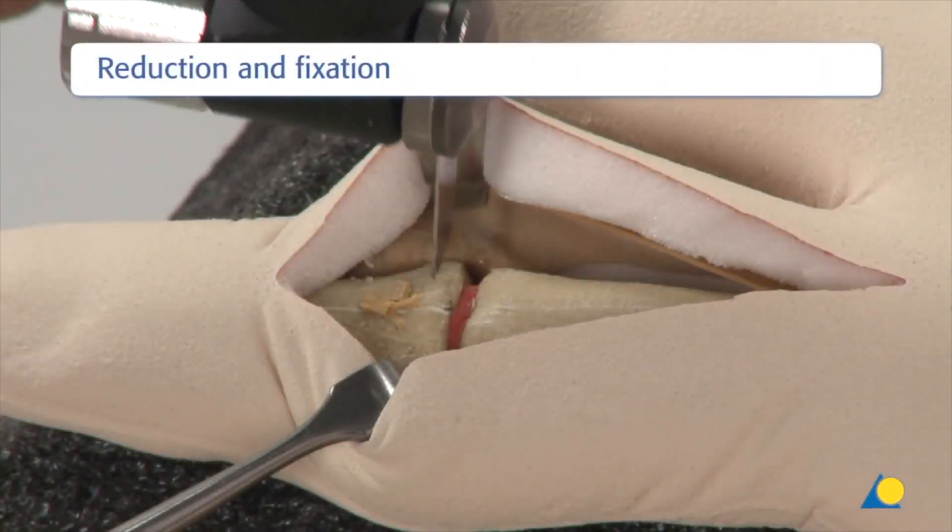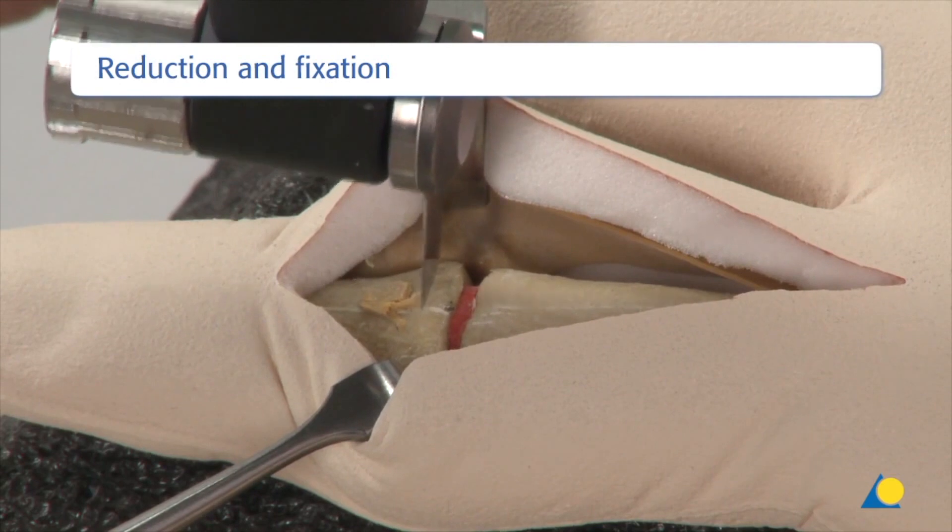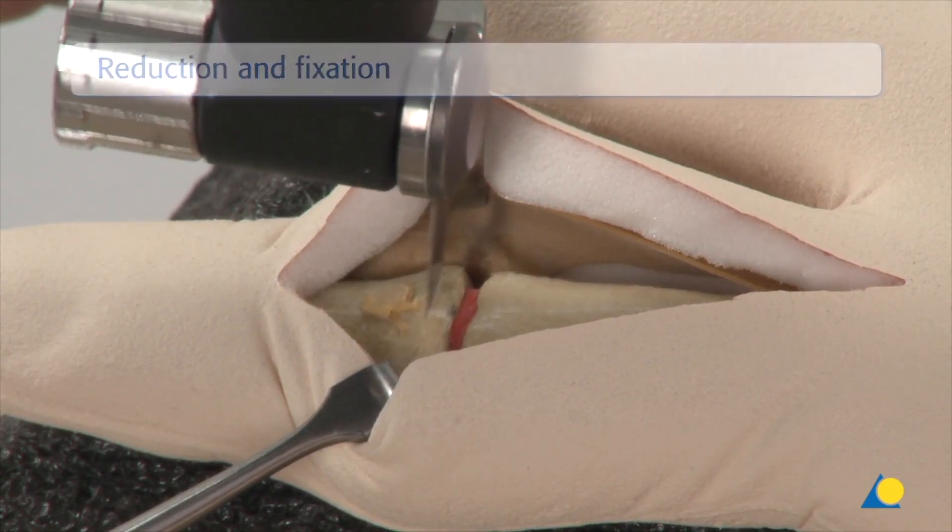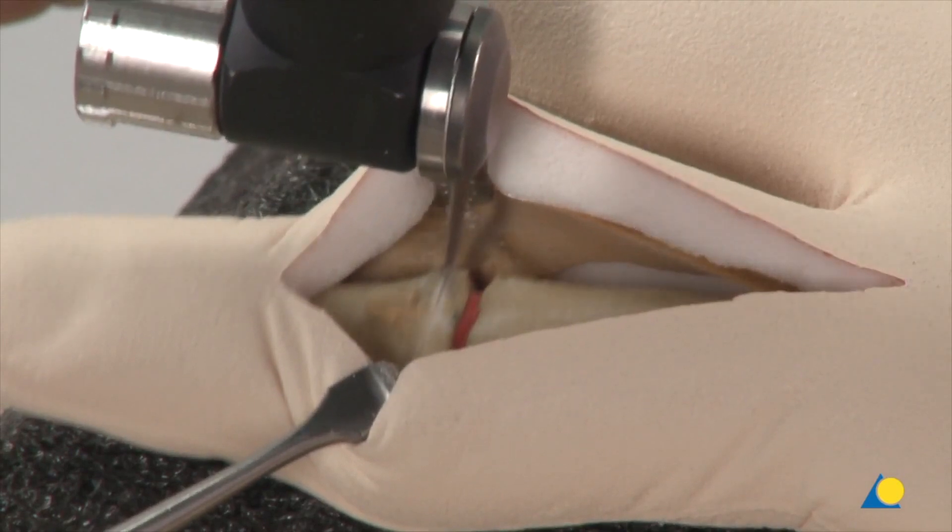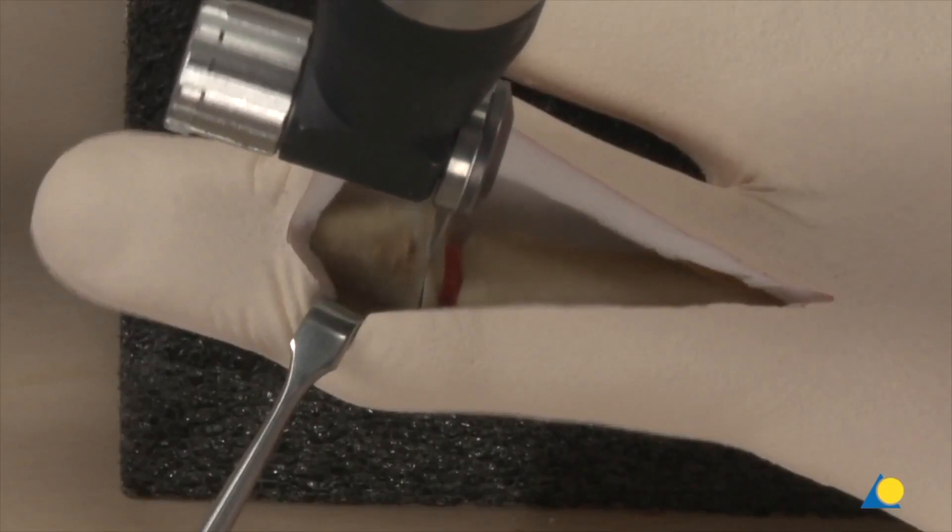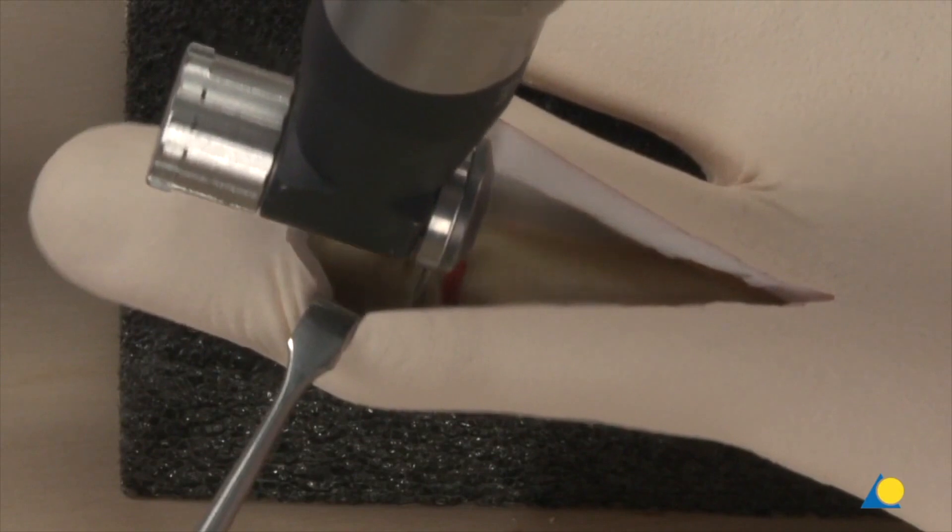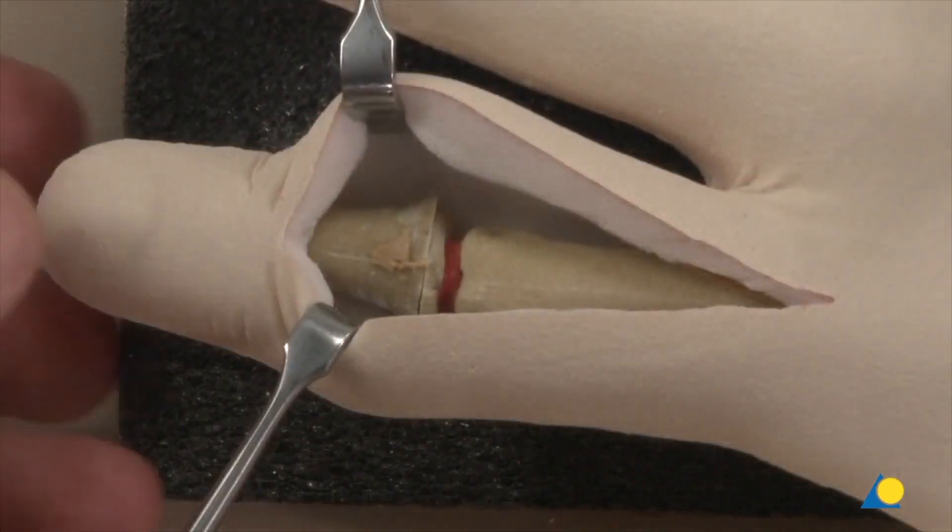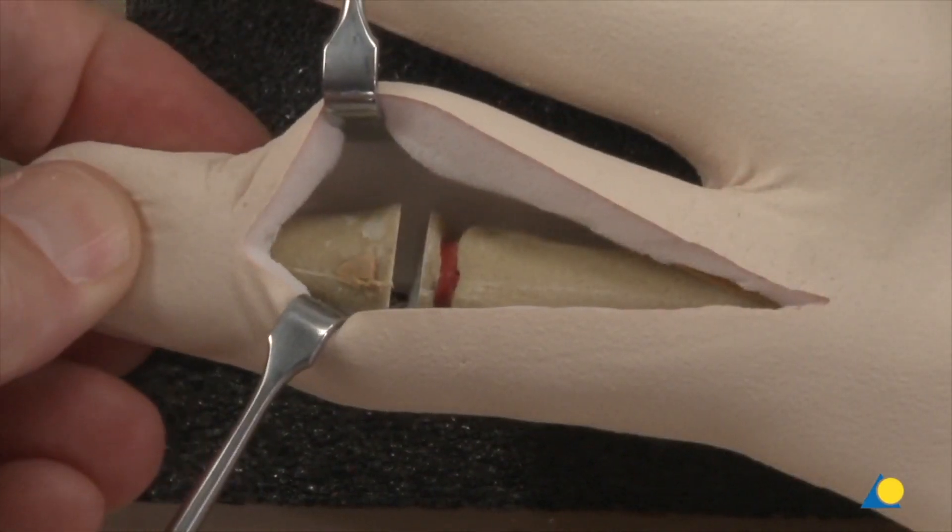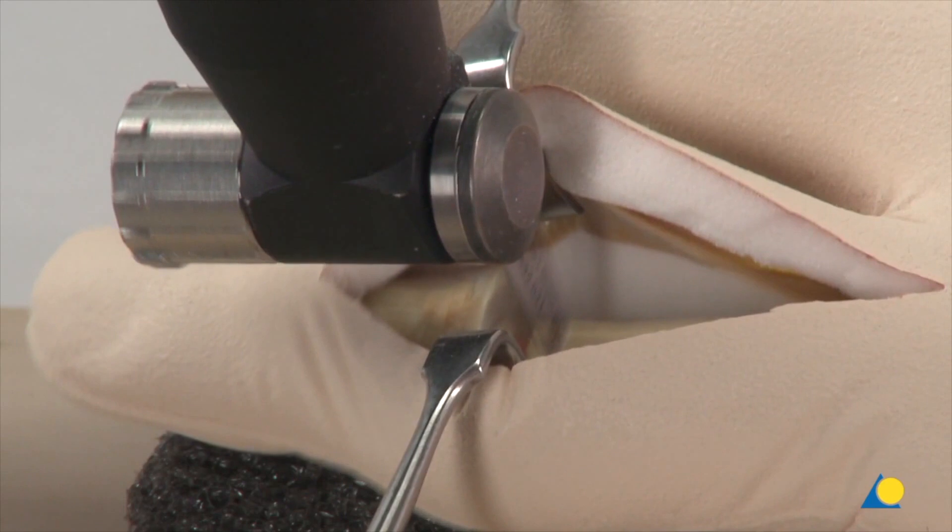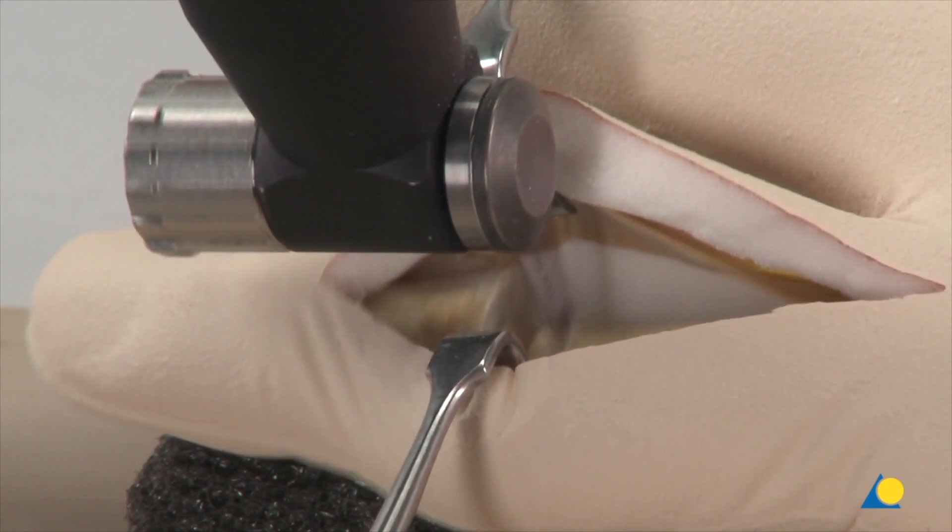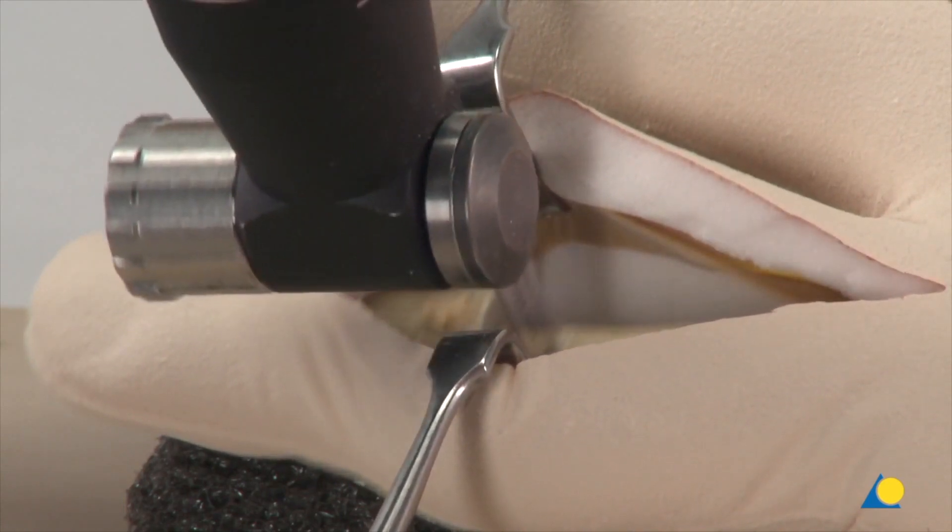With the oscillating saw, the osteotomy has begun perpendicular to the longitudinal axis of the middle phalanx. Both the remaining cartilage, as well as the subchondral bone, must be removed in order to obtain a flat cancellous bone surface. However, to prevent excessive shortening of the finger, only as much bone as necessary should be removed. The osteotomy is completed through the head of the proximal phalanx at the chosen angle for arthrodesis.